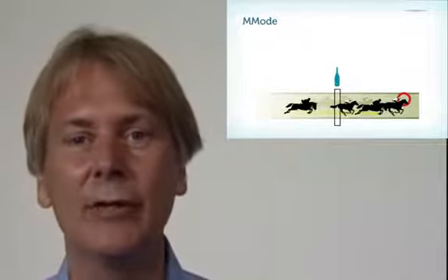In this chapter, I started telling you all about two-dimensional imaging. But from a historical perspective, it was not 2D imaging which was first, but it was M-mode. And this is the textbook that I learned echocardiography from. It's the famous Feigenbaum, the second edition. If you take a look at the images in this book, you will see that most of these images are actually M-mode images. Of course, M-mode has lost a lot of its importance. But still, if you know how to interpret M-mode images today, you will get much more out of echocardiography. And how can one best explain what M-mode is?